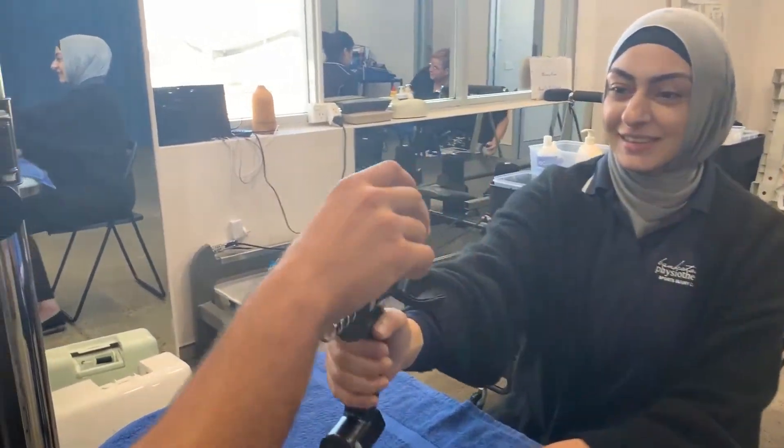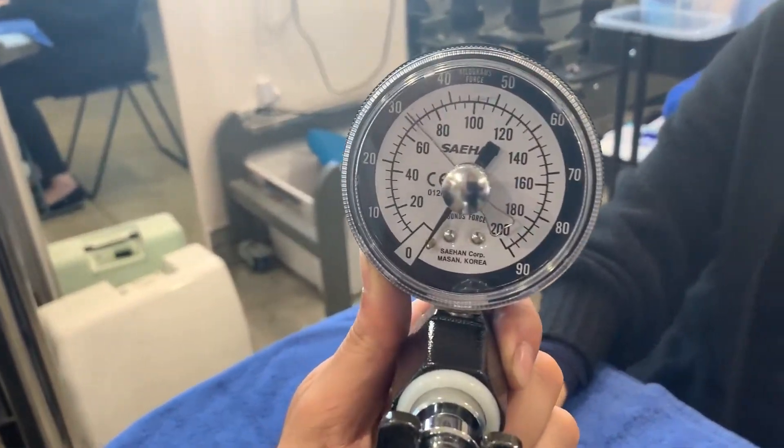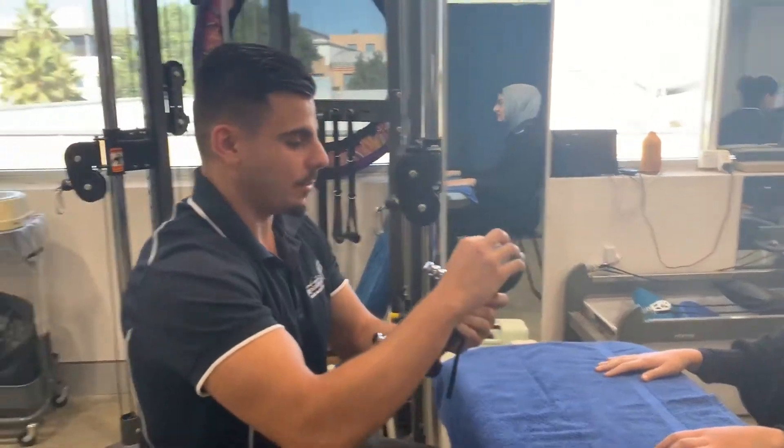That little back pin has now pushed the silver one over, and that gives us a reading of kilos or pounds of their grip strength.